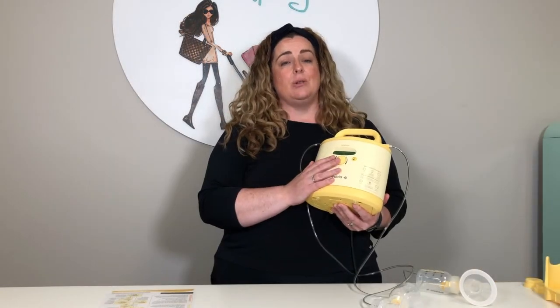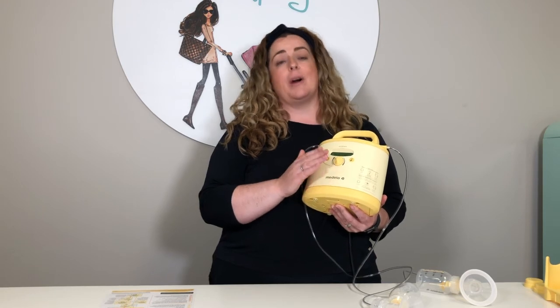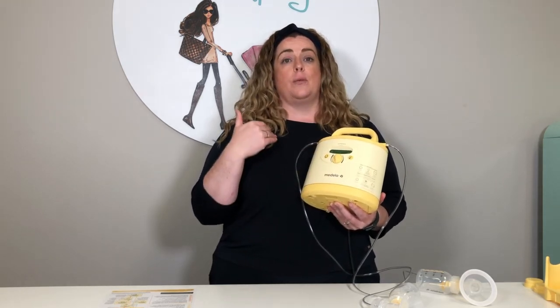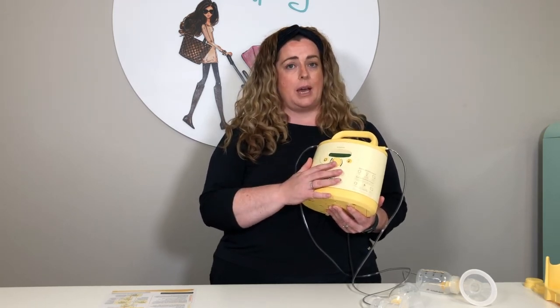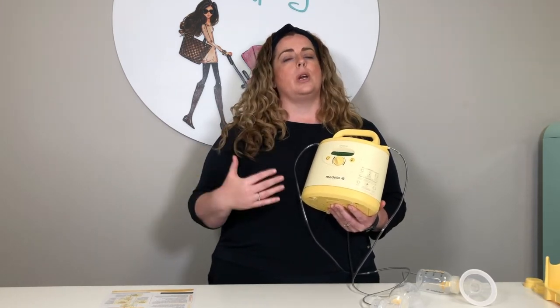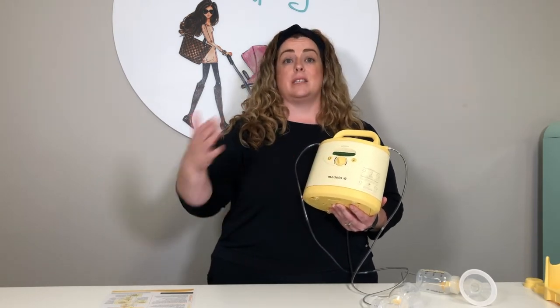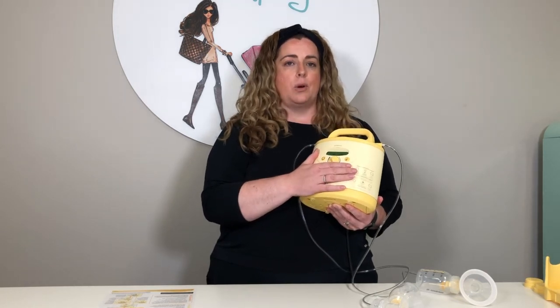To get the best use out of the pump, use the program that is designed to help you at the stage that you're at. So that means as you've very newly had your baby, you're going to be initiating your milk supply, or if there is a delay in your milk supply coming in for a medical reason, or you've been distanced from your baby, or your baby's not successfully breastfeeding and so you're using the pump as a bridge to being able to go back to breastfeed, that's when you'll use the initiate program.